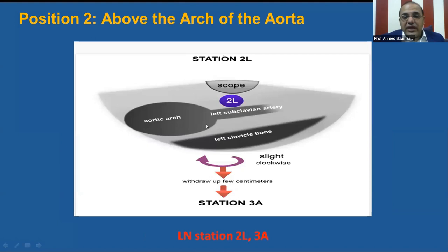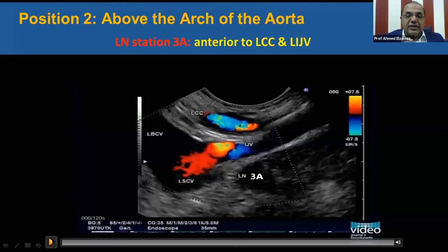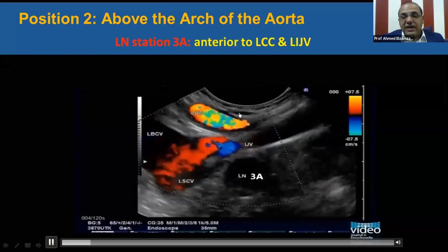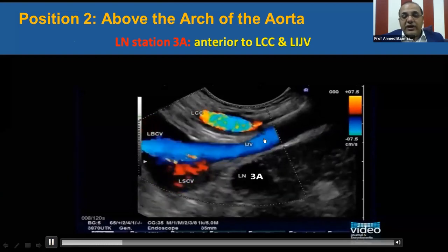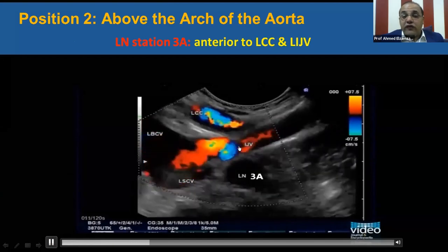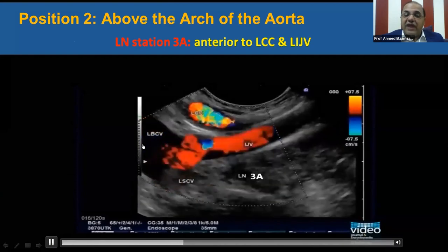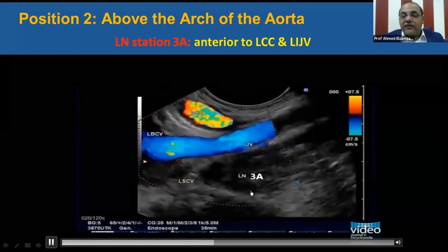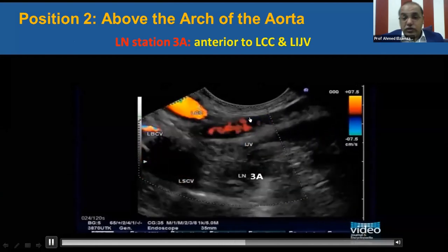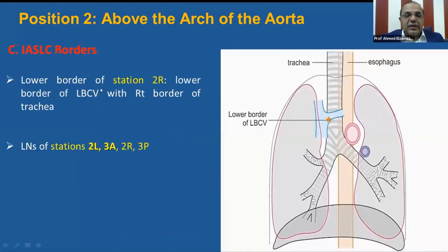With clockwise rotation and withdrawal of the echoscope a few centimeters, we find the left common carotid artery from the left subclavian artery, so we swing from station 2L to station 3A. As seen in this video, this is the left common carotid artery. In front of it is the venous confluence — left internal jugular vein joining the left subclavian vein forming the left brachiocephalic vein — and lymph node station 3A lies in front of the left internal jugular vein and the left common carotid. So position 2 includes lymph node station 2L and 3A examined by EUS, while 2R and 3P are not examined by EUS.